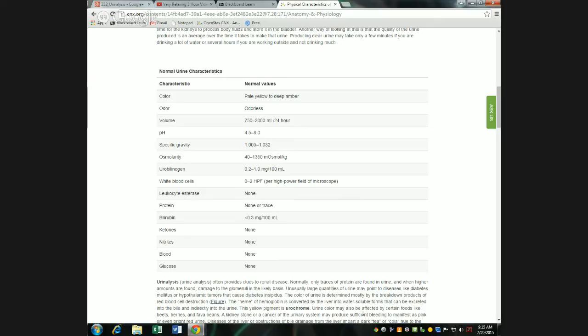So I did not do it just to gross you out. I also did it to kind of reinforce the idea that urinalysis is just anything you can do to figure out what's going on in the sample. Luckily, you're going to be doing it in a much more modern way, but sight, odor, taste, all of those are ways to find out what's going on in urinalysis.